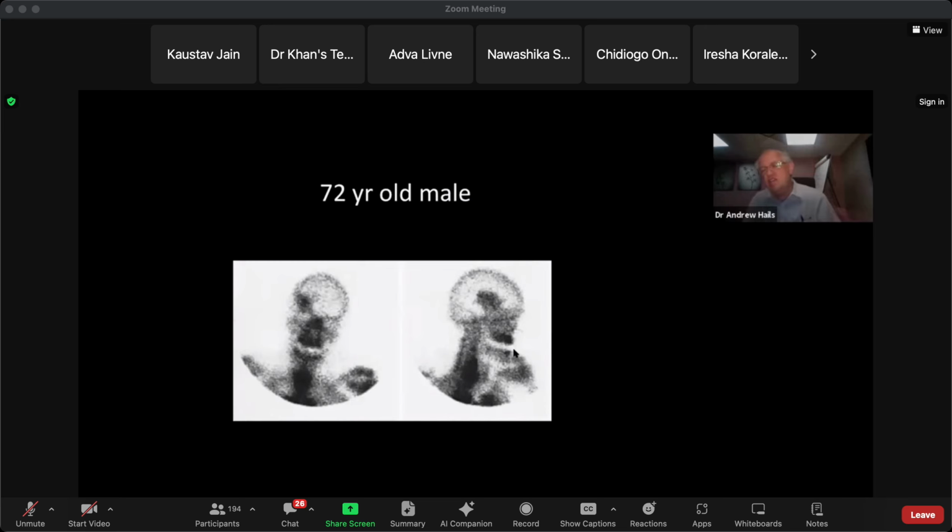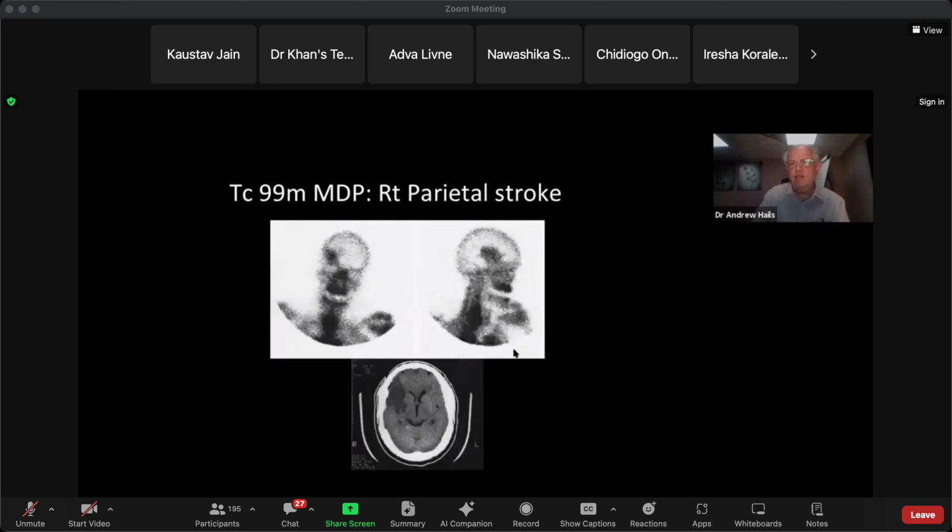And you get calcification with a meningioma quite often. And anything in the body that can produce calcification, even if only a weeny bit, can show up on a bone scan. Now, this is unusual.